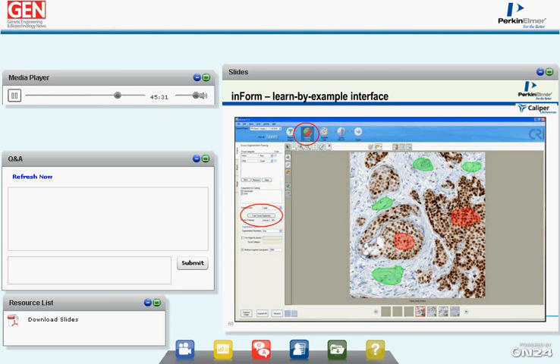And then in the background, machine learning approaches, including neural networks, are used to find a reliable algorithm that can then be used subsequently to segment other images. And now in this image, you can see how there is now a red and green mask on top of the image. The red is showing where the tumor is, and the green is showing where the stroma is.